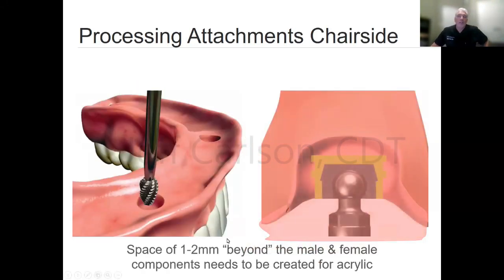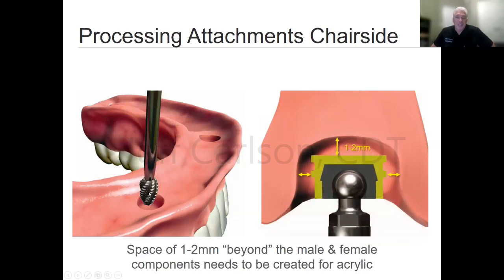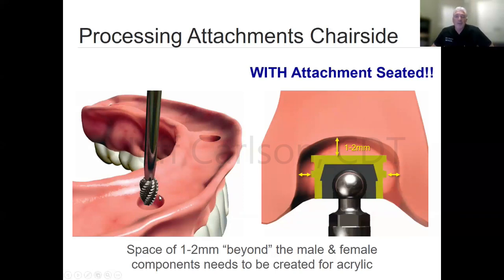When you're going to relieve inside of a denture, Zest actually has some nice tools as well that create some undercut to remove the right amount, and a burr goes in and creates the undercut. They've been doing this for years, and they've got some neat instrumentation to make this more predictable and more user friendly.